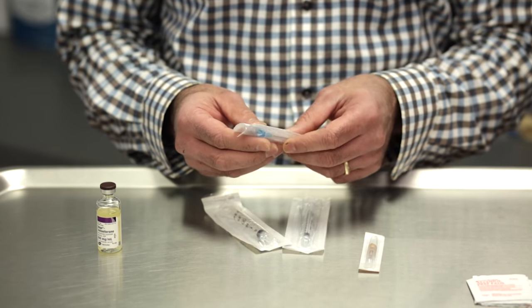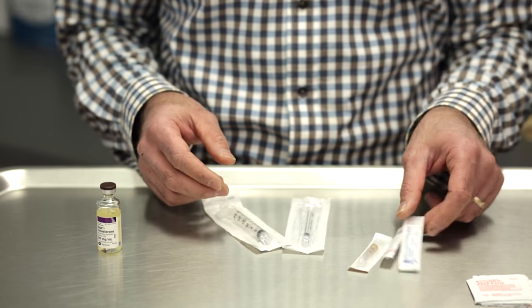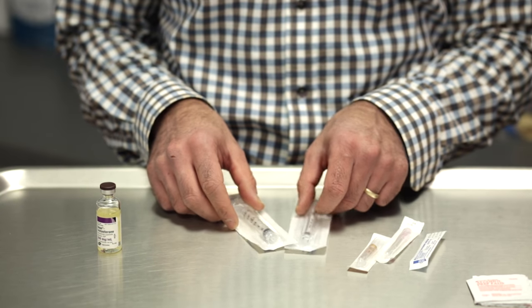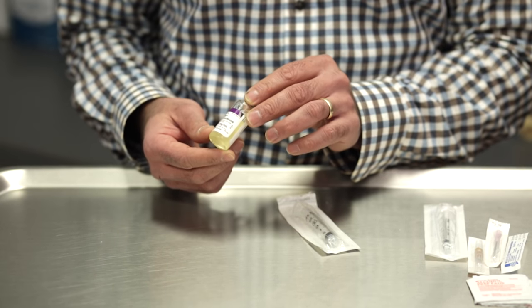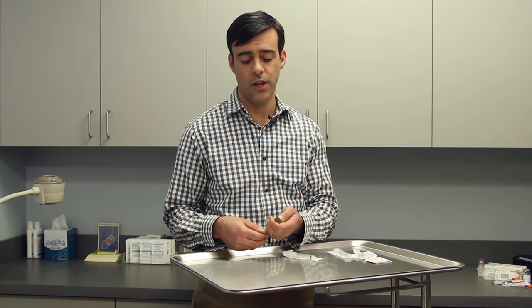The syringes and needles will either have been given to you by the office or you should have received them from your local pharmacy. The first thing to do to draw up a dosage of testosterone is to remove the cap from the bottle.